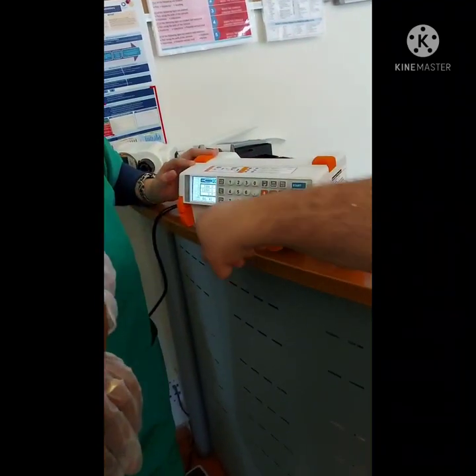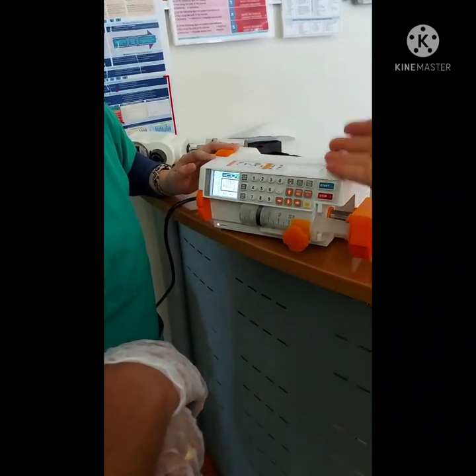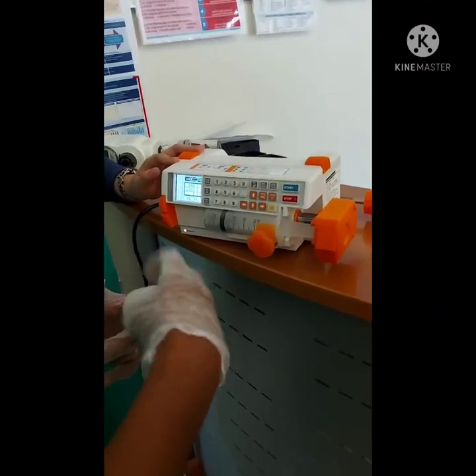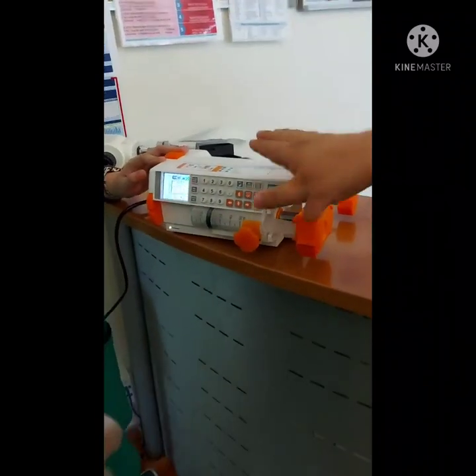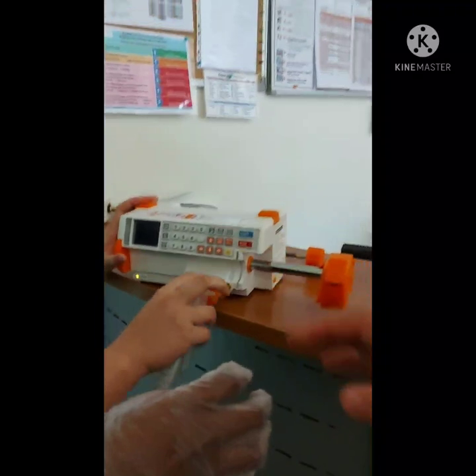You have a value. The time and how many hours, the value given. Put it in the patient. Now it's good. Can you close and try by yourself, please? Keep it here to learn.